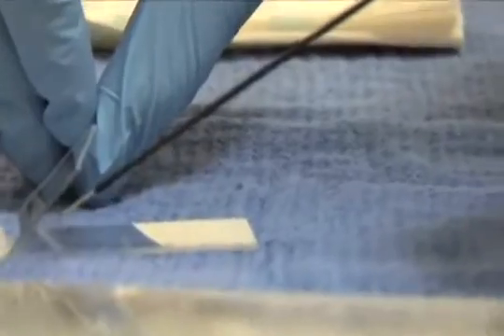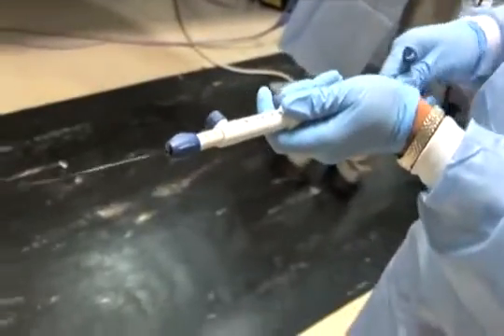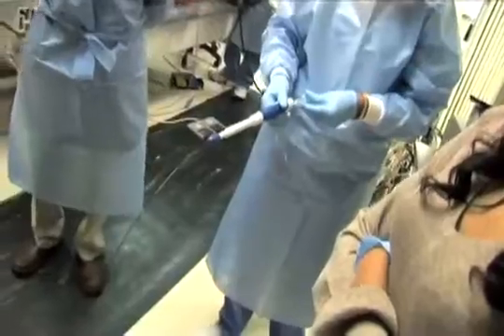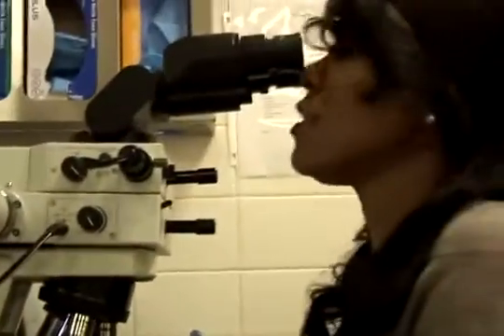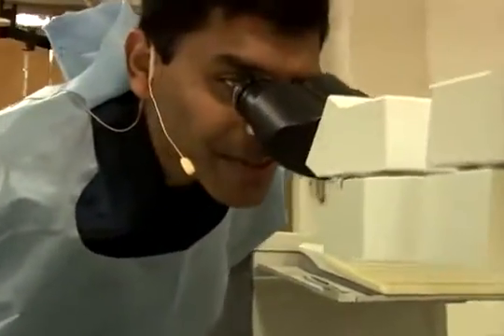The FNA sample is expressed to the slides by having the tip of the needle positioned on the slide, and then using a stylet, we express the specimen out onto the slides. And once you have reached the very end of the stylet, we usually use a syringe to flush air into the needle apparatus to get all the specimen onto the slides. Usually we make about 3 slides, and usually the pathologist will render analysis within 2 or 3 passes.